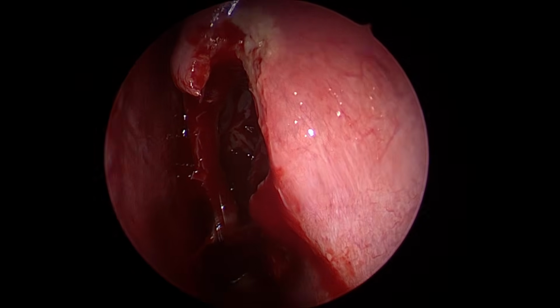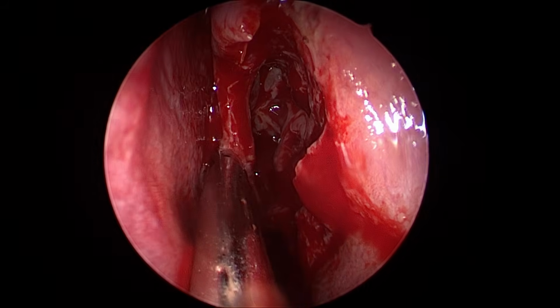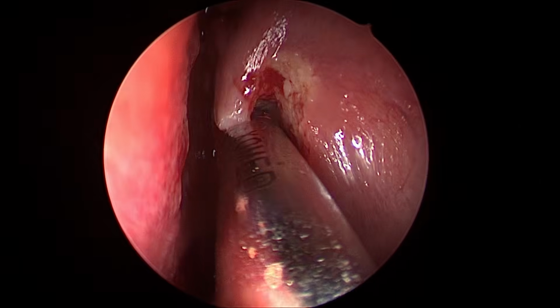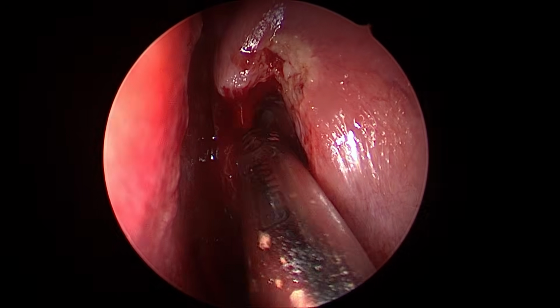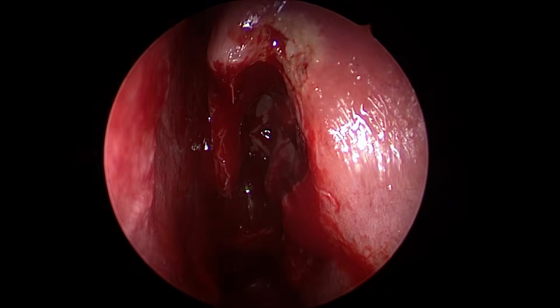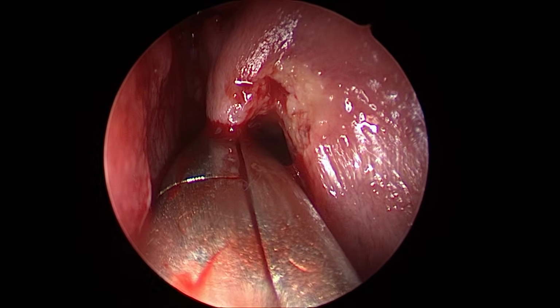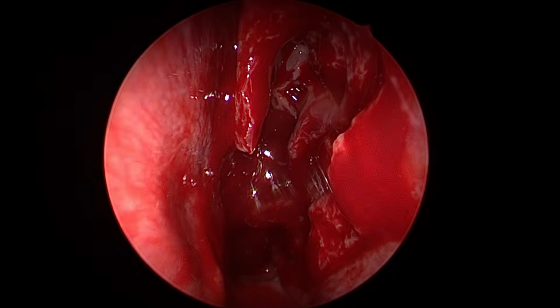See the access to the olfactory now. First of all, I have not pulled the turbinate at all. It is attached to the cribriform above. Number two, I have not completely removed it. See this? I have kept it as a landmark above. This is important for the skull base. But it is trimmed enough to prevent it from becoming an obstruction in my olfactory, in my irrigation.